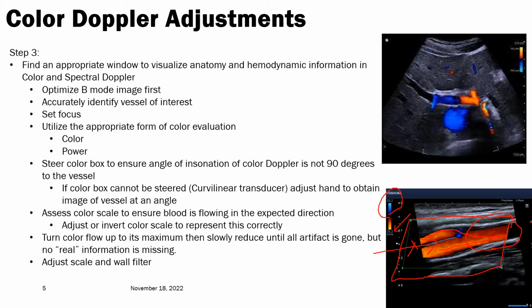So you see what the technologists did here was they inverted that color scale to make an artery look red, but to ensure that the flow was going the right direction, they can evaluate where their scan lines are going, see that the blood flow would be moving away from the scan line rather than toward, know that that would be a negative Doppler shift and would therefore be represented as red because in this instance, red is demonstrated below the baseline on our color scale.